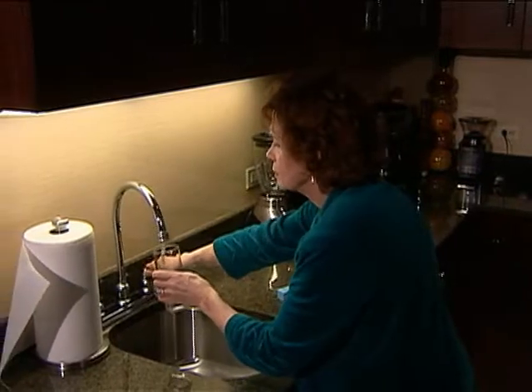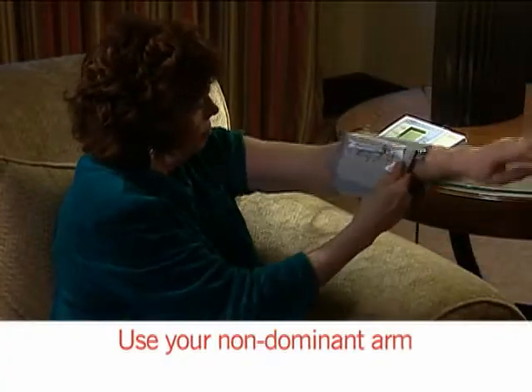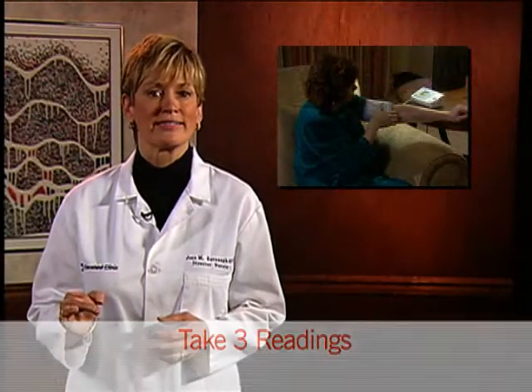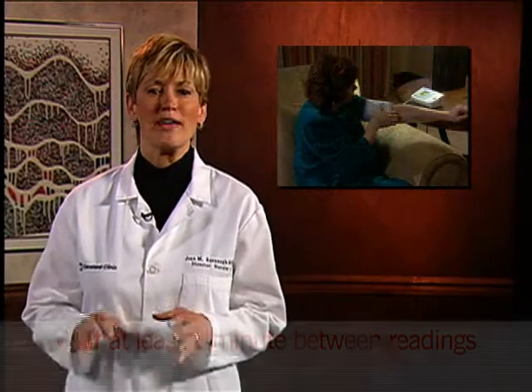You may find it easiest to measure your blood pressure in your non-dominant arm. For instance, if you are right-handed, you should take your blood pressure in your left arm. When you measure your blood pressure, take 3 readings. Wait at least 1 minute between readings. And don't worry if one of the readings is high or low. Blood pressure readings tend to vary a great deal.